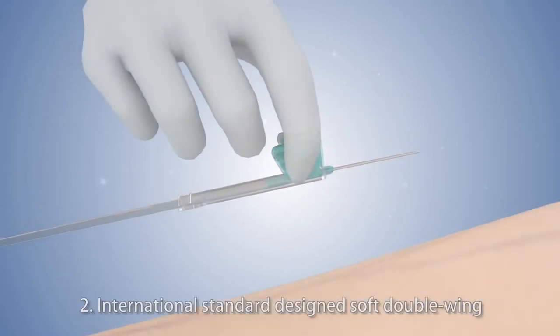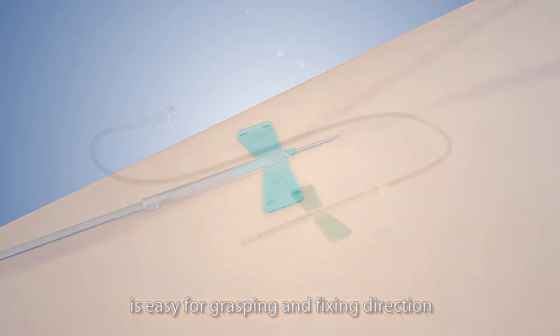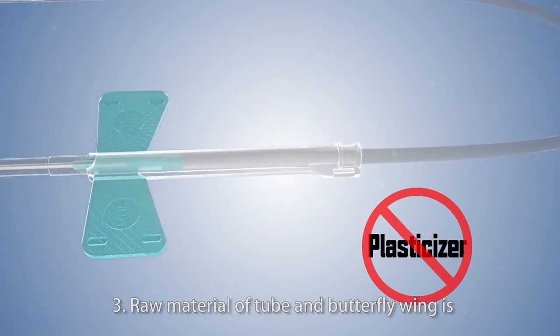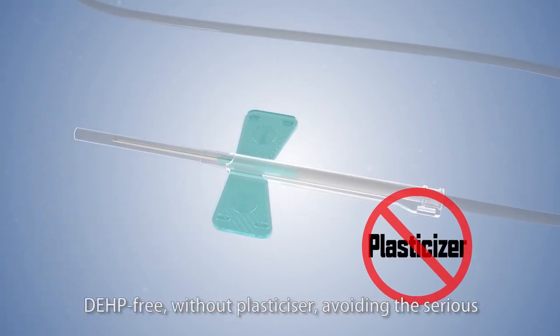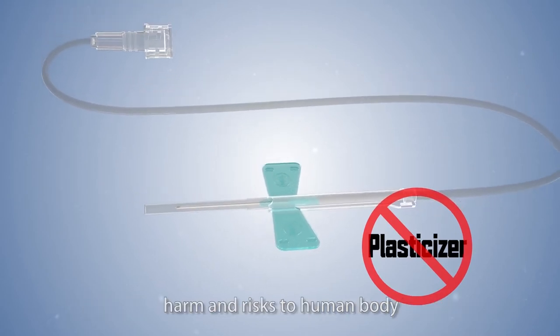2. International Standard Design Soft Double Wing is easy for grasping and fixing direction. 3. Raw Material of Tube and Butterfly Wing is DEHP-free, without plasticizer, avoiding the serious harm and risks to human body.